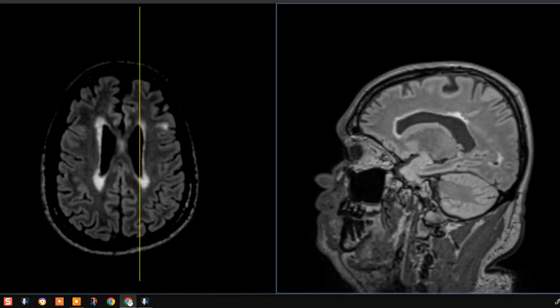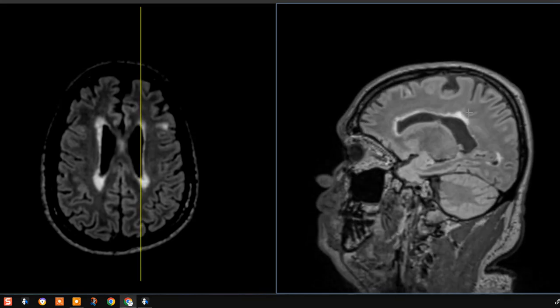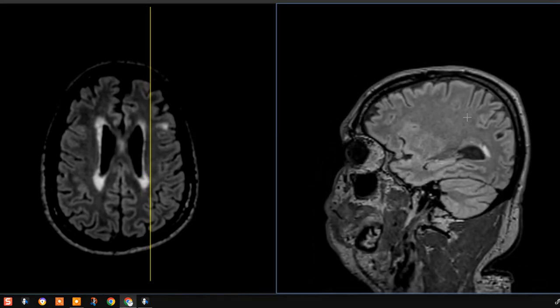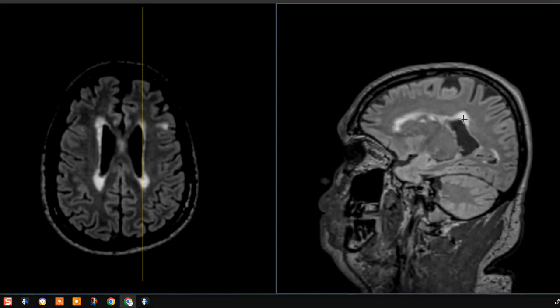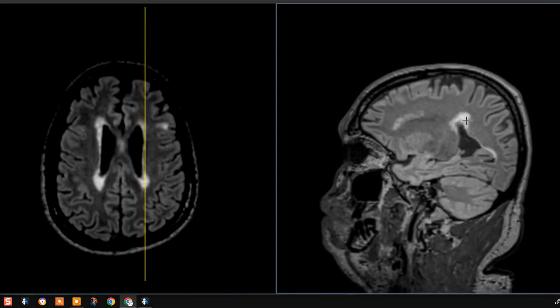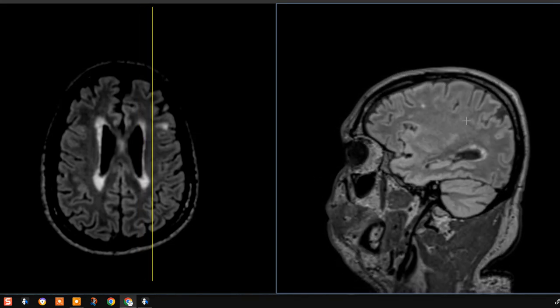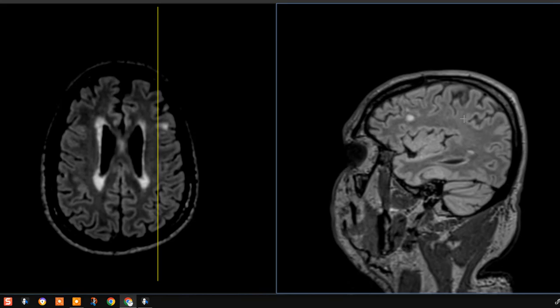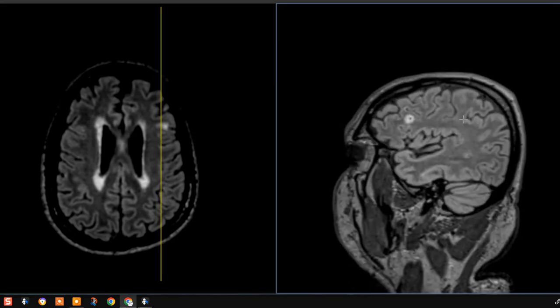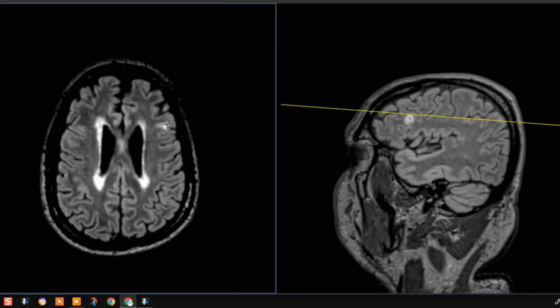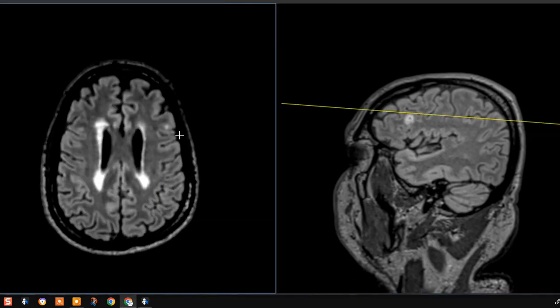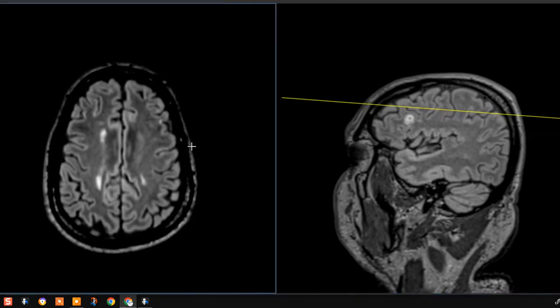Now this patient also has lesions in their cortex. MS typically involves the deep periventricular white matter or pericallosal white matter, but sometimes it can also involve other portions of the brain including the cortex. Right here we have a cortical lesion corresponding to this area over here, and as we go up and down we can see more and more of these cortical lesions.